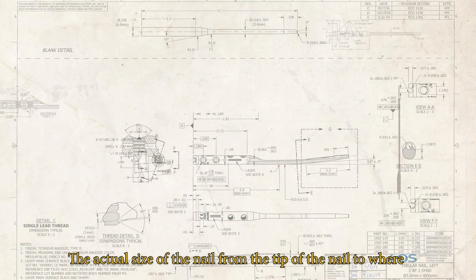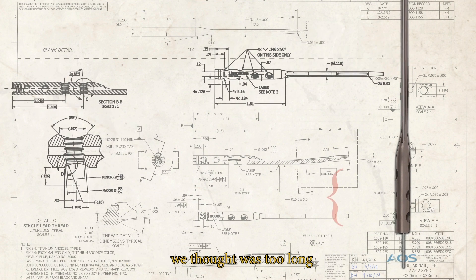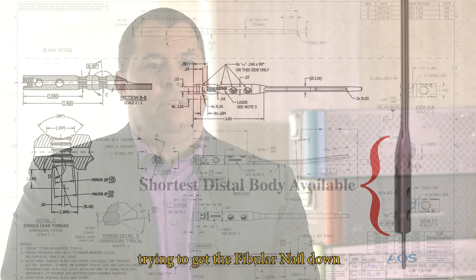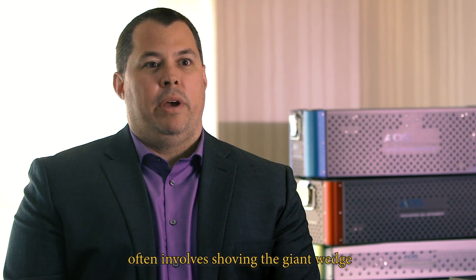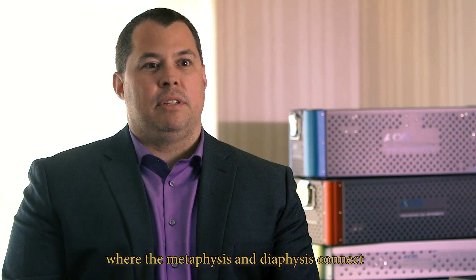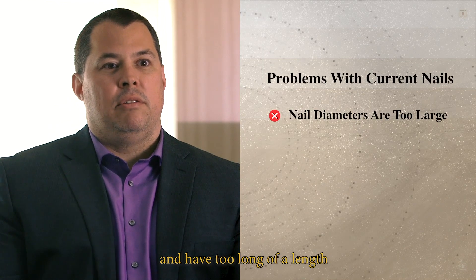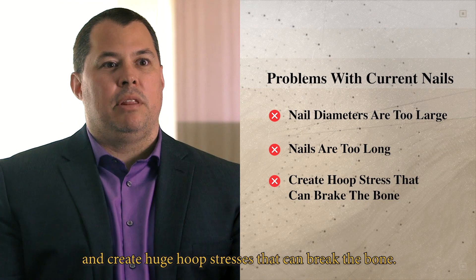The size of the nail from the tip to where the shaft portion begins was considered too long. If you've done a lot of fibular nails, trying to get the nail down flush or inside the lateral malleolus often involves forcing a large wedge of the nail up into where the metaphysis and diaphysis connect. For many patients, current nails on the market are just too large, with too long a nose length, creating huge hoop stresses that can break the bone.